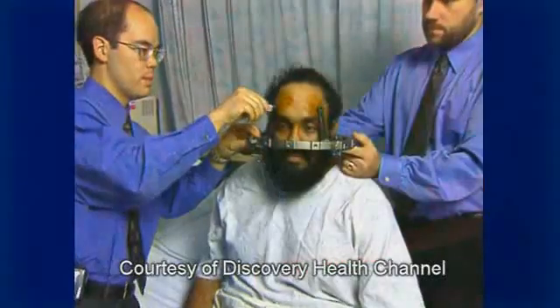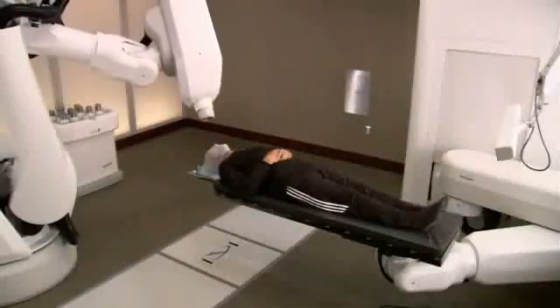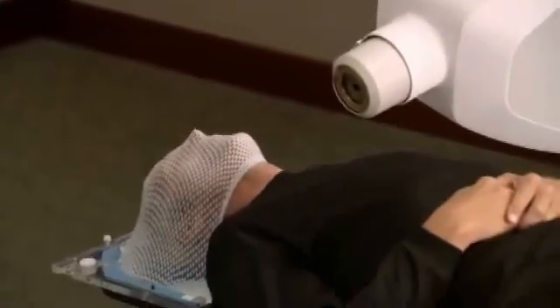Unlike other radiosurgery systems, such as the Gamma Knife, the CyberKnife system does not require patients to be fitted with a rigid and invasive head frame. As a result, you will be more comfortable while your radiation is delivered with extreme accuracy.